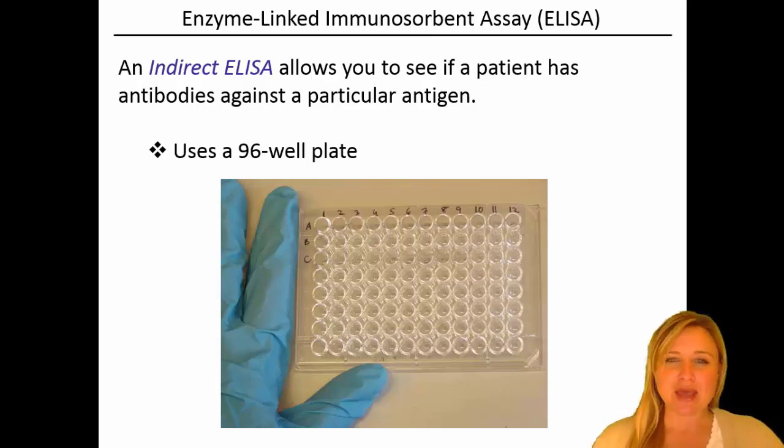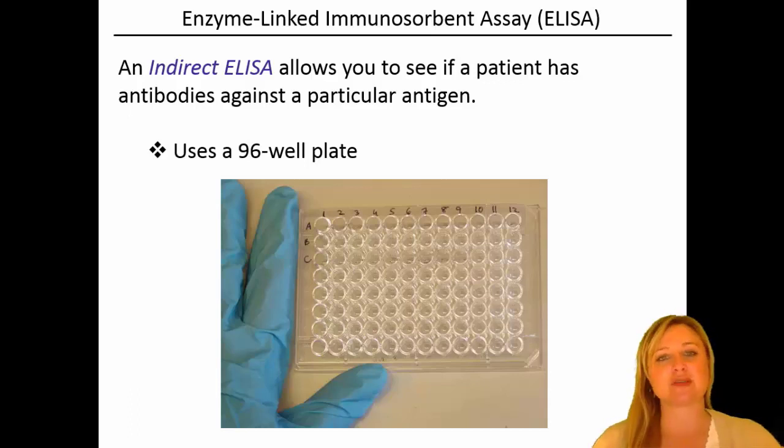And if we can't find the pathogen in the blood, well, we certainly can find antibodies against the pathogen in the blood. So, for example, if you get a blood test to see if you've been infected with HIV, that blood test doesn't actually look for the human immunodeficiency virus. It looks for antibodies against the human immunodeficiency virus. Because if you have antibodies against HIV in your system, then that means that your immune system cells have seen HIV and created antibodies against it. And if you've seen HIV, that means that you're infected with it.